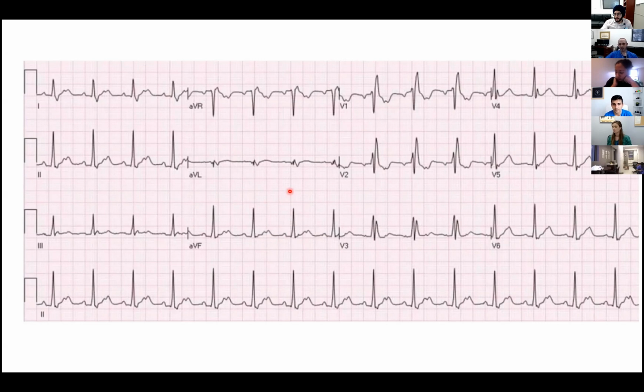And then if we say, okay, this is not going to be an atypical flutter, based on morphology, you have a nice isoelectric line between two P waves, which goes against flutter. And then you have a clear, different type of morphology. You have positive in 2, 3 and aVF, negative in V1, a really distinct P wave. So that tells you more of an organized activity, a little more organized than flutter.